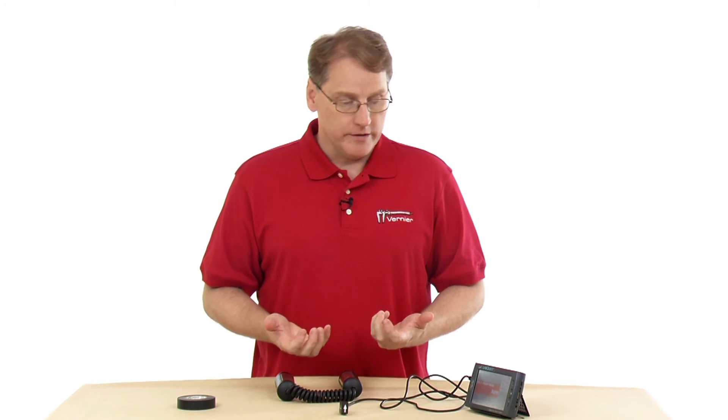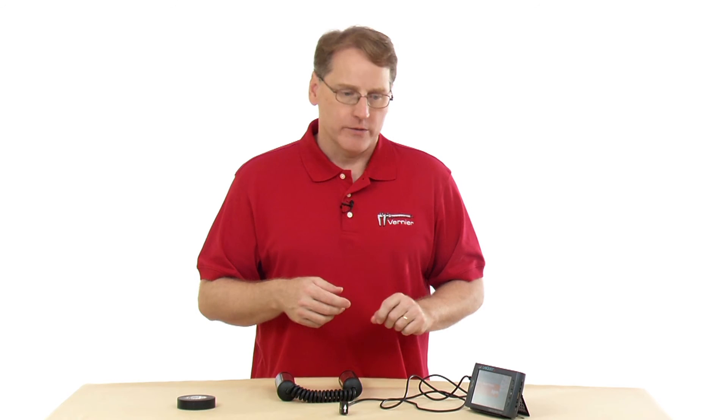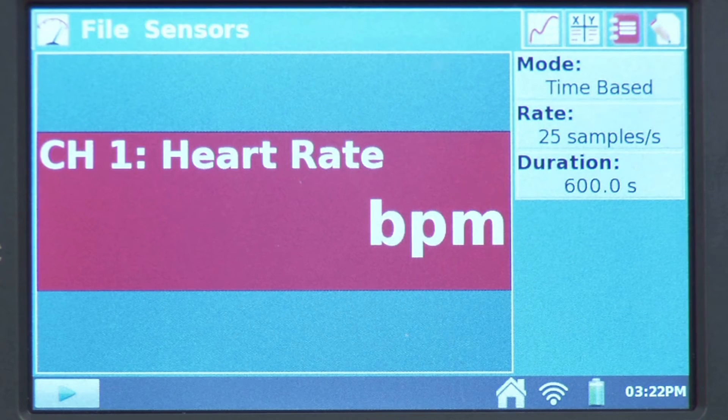With this sensor, no number shows up immediately because it has to calculate beats per minute — it doesn't display any value until it's already collected some data. It's collecting those changes in electrical potential, akin to measuring your pulse for a period of time and then counting how many beats occurred. So it's not uncommon for someone to plug it in and say it's not working — it simply doesn't show anything until you begin collection.